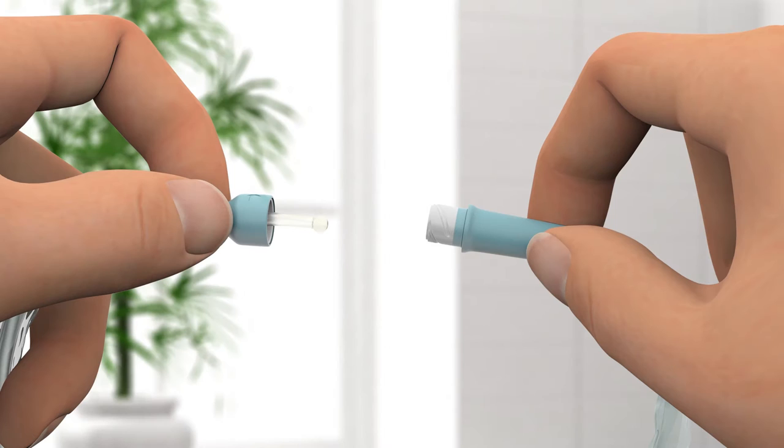Make sure that the catheter tip does not touch anything before you enter it into the urethra. If it does, you must use a new catheter. Touching the sink or your clothes or skin, for example, will contaminate the catheter and can potentially cause infection.